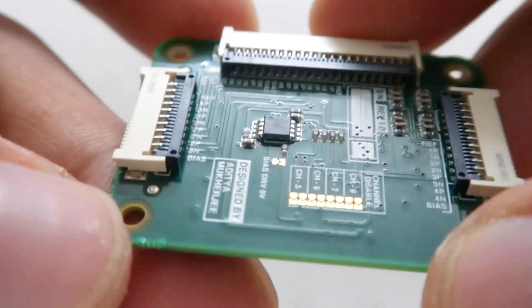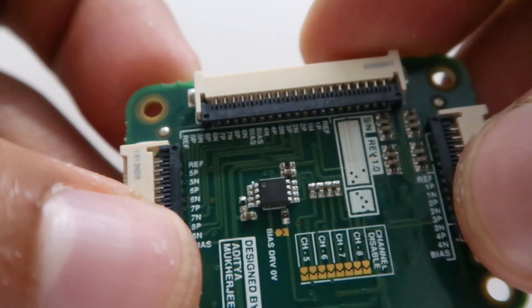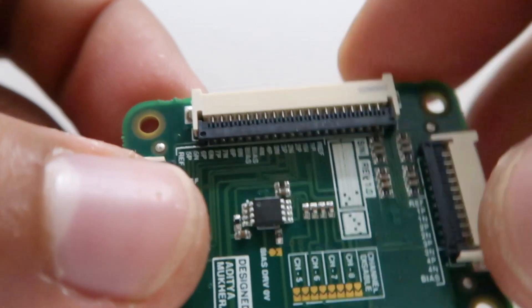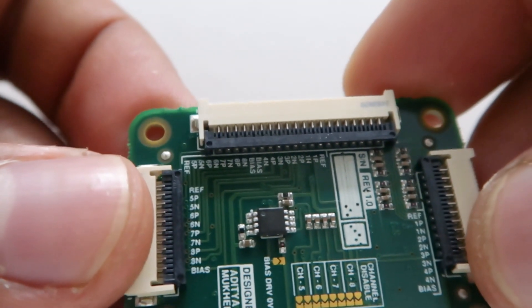On the bottom side there isn't much, except three FPC connectors which are designed to accept the EEG signals from the scalp electrodes.